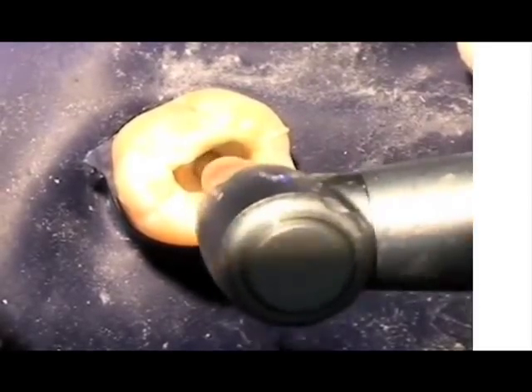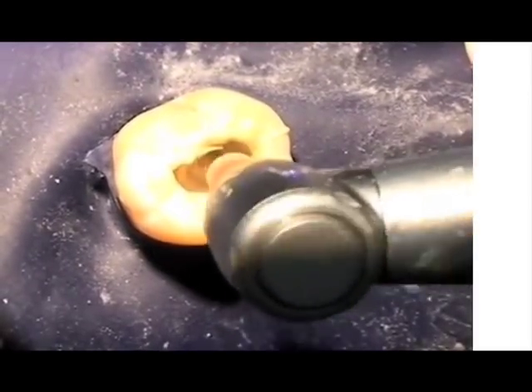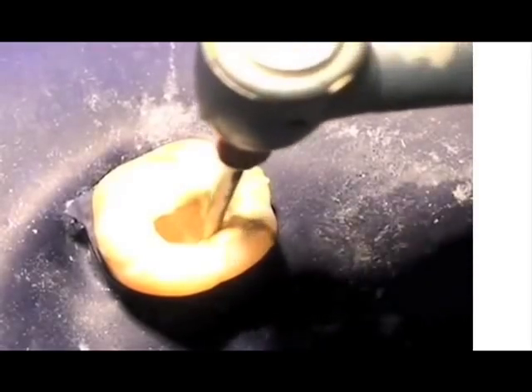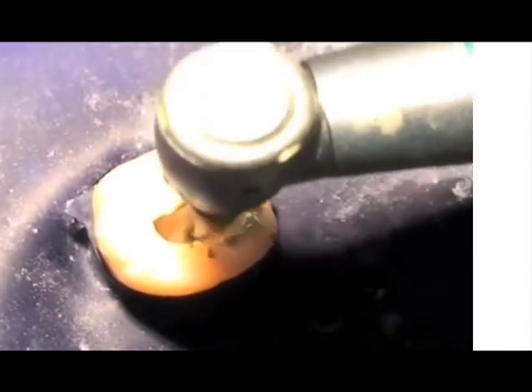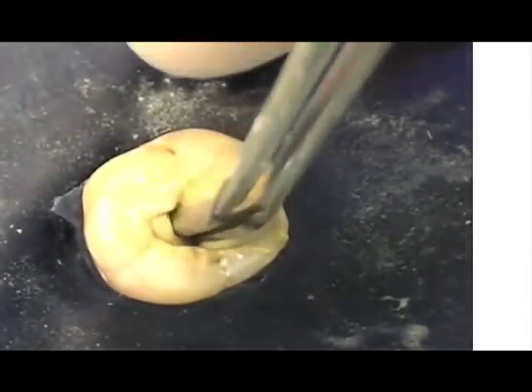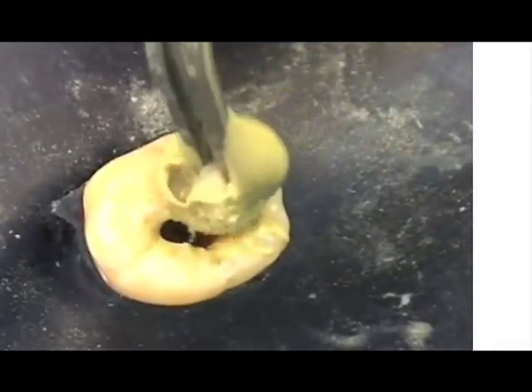You may note that the pulp chamber is flooded with cement. This is usually no problem and the excess cement in the chamber acts as a well of cement. However, if you feel you cannot find the canals with ease, you simply take a small ball of cotton and wipe out the excess cement in the chamber, letting you see the orifice openings of each canal more clearly.